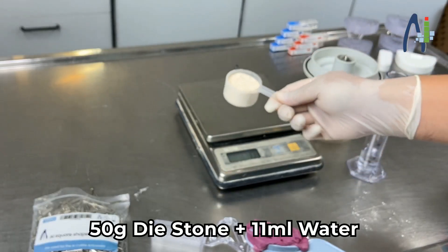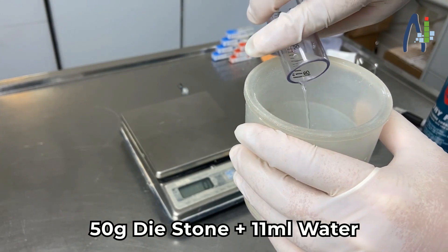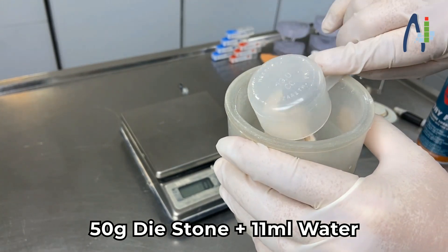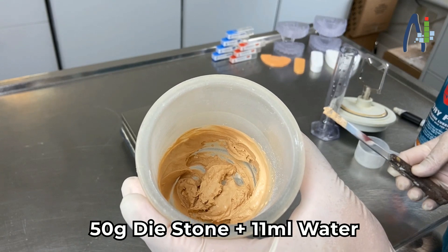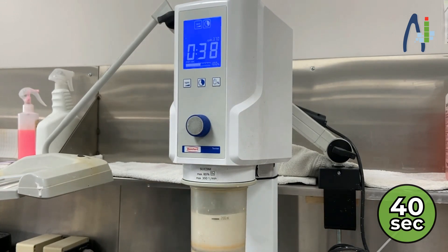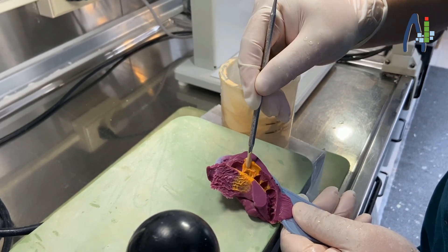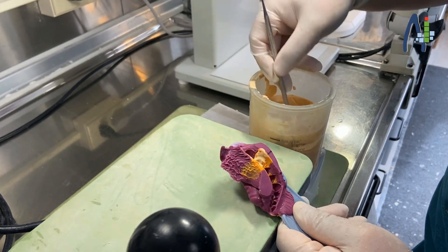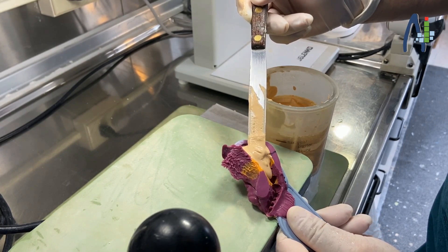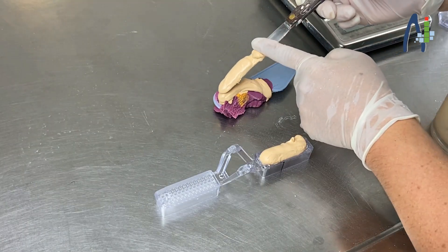Please mix 50 grams of dyestone and 11 milliliters of water. Water should go first to minimize bubbles. After you mix them with a spatula, vacuum them for 40 seconds. Put the mixture into the impression, then cover the pins with the mixture. Be sure to give some bulk on the impression.